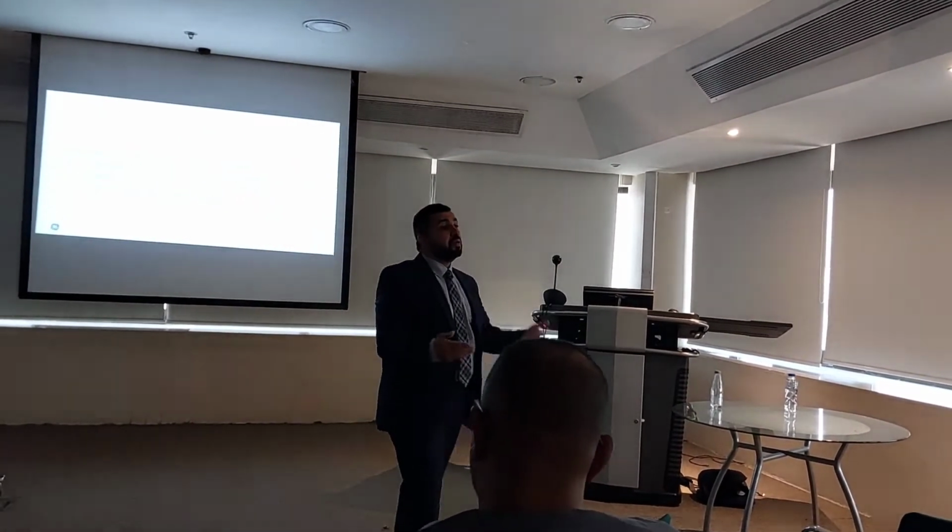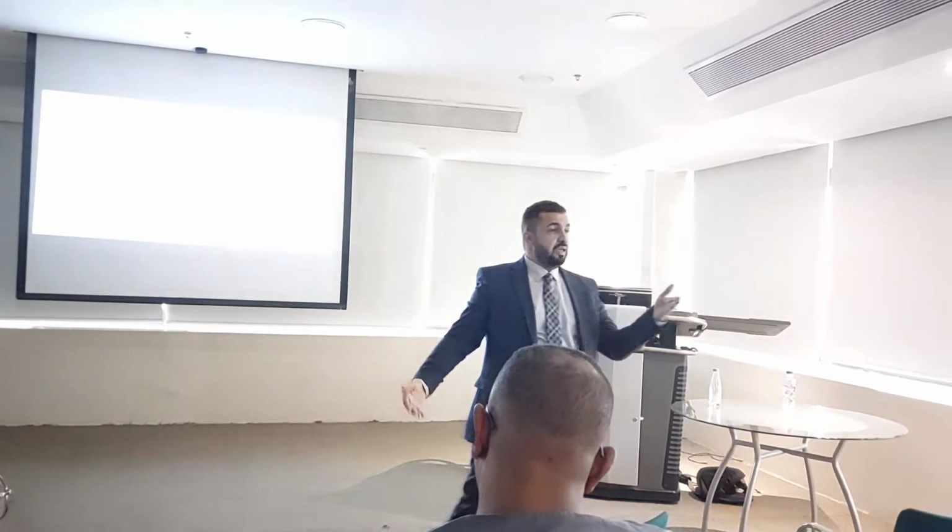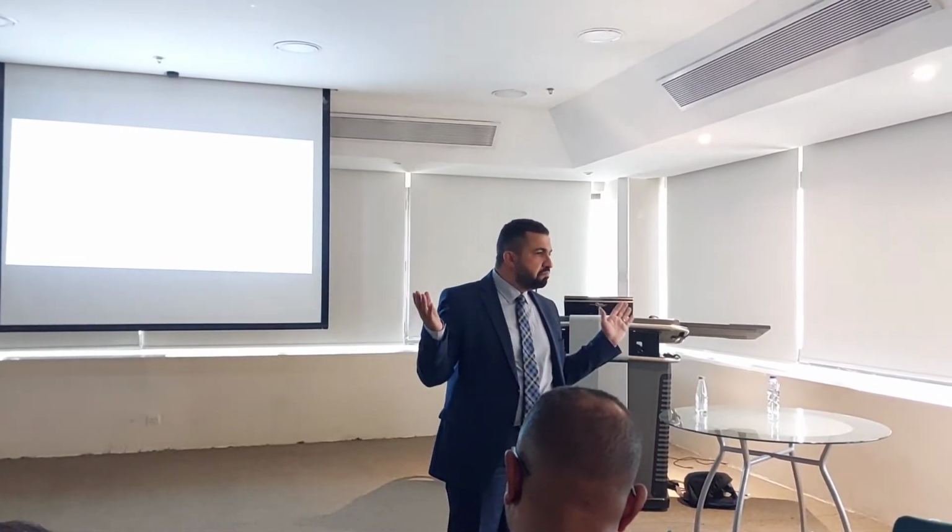Right? Now, because of that, if I have the ECG signal and all the others, the machine is good, and the patient, for example, cannot stay still, or cannot hold his breath, I cannot do that. There is no way to do that. Don't do it. It's one of the things that must happen. Okay?